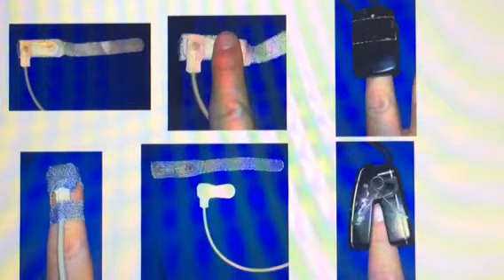The pulse oximeter probe is most commonly placed on the finger, then on the toe, and sometimes on the earlobe. It can only be placed on the nose or forehead when used with a specialty probe specifically designed for that area.